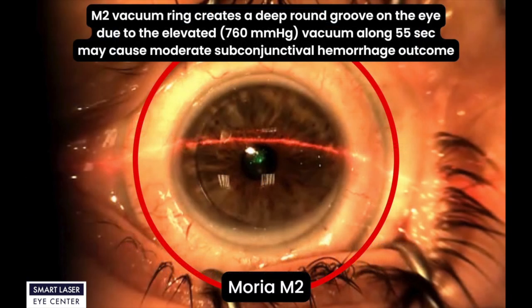Now let's examine the Moria M2 flap creation. As you see on the Moria M2 video capture, the M2 vacuum ring creates a deep round groove on the eye due to the elevated 760 mmHg vacuum pressure. This 55-second vacuum duration may cause moderate subconjunctival hemorrhage outcome.